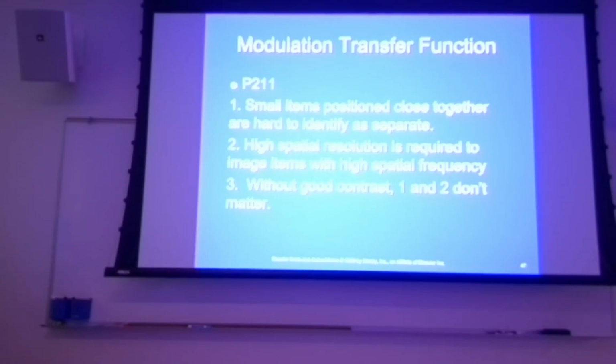So where the computer manipulated image shines and where we really get a benefit is in that dynamic range. Where things tended to blend together because of poor contrast before, with the superior dynamic range of the computer processed image and the computer algorithms, we can ferret out that contrast.